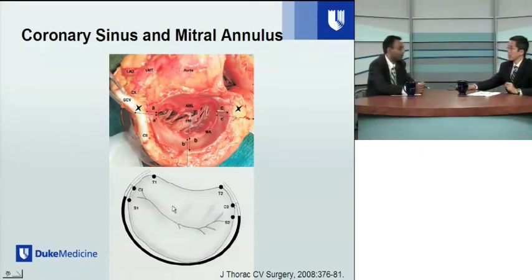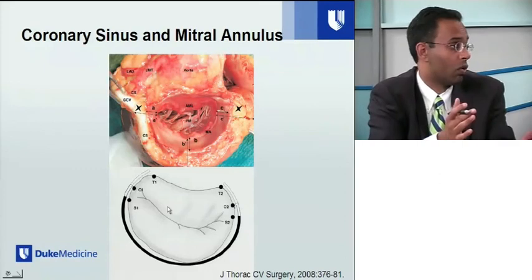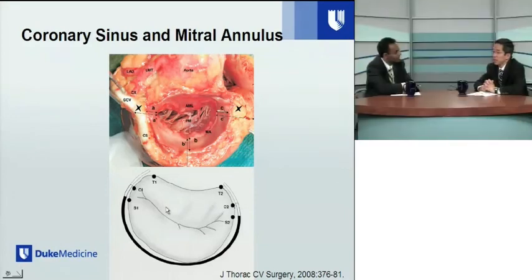And I imagine that in patients who, for example, do have advanced heart failure or are appropriate candidates, they may have already had their coronary sinus access with a biventricular lead, for example. I imagine there's some technical challenges with deploying these devices in that particular situation as well. Or if a patient would subsequently need access to the coronary sinus, I would imagine might be challenging. Yes. I've seen a few case reports describing the patency of coronary sinus to allow access for future devices. I don't know about whether the reverse is true.